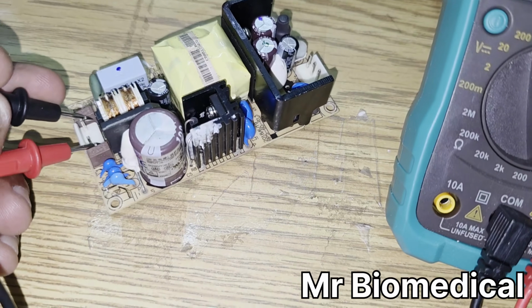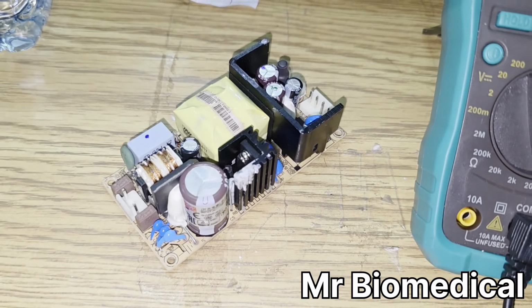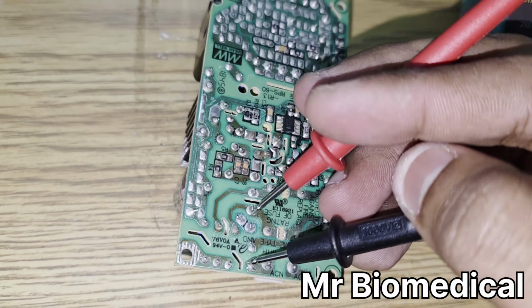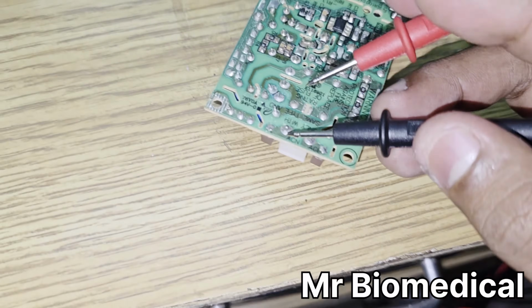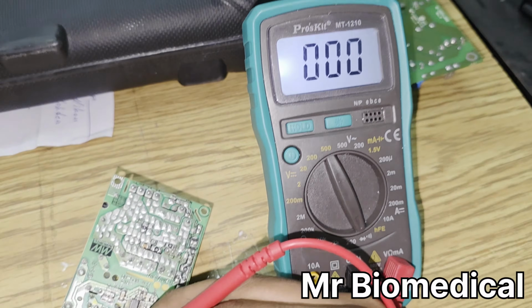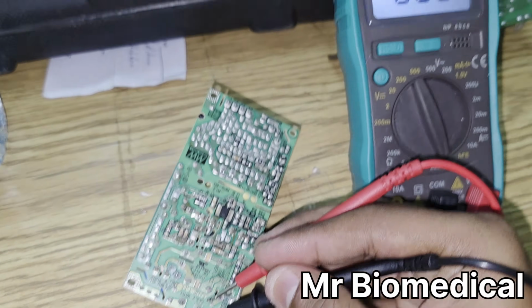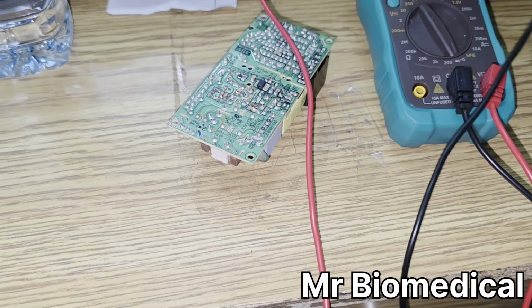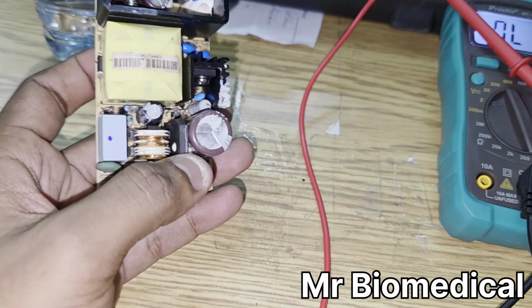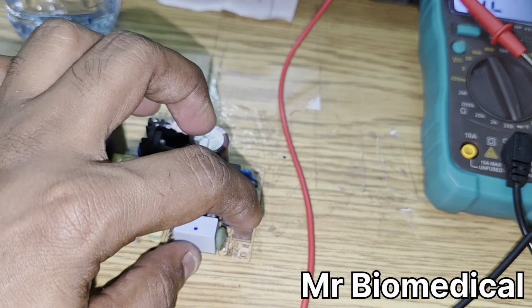The first step is to check the terminals. As you can see, there is no short. The second step is to check these fuses. You can see one fuse is fine, and I'm checking the second one. This is also fine. So there is no short in the primary side. I'm assuming that, but we have to check the bridge rectifier. Maybe the bridge rectifier is open, or the capacitor is open, or the inductor is open, or something else. But the initial step is the fuse checking and the terminal checking.